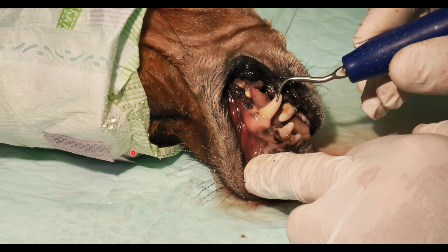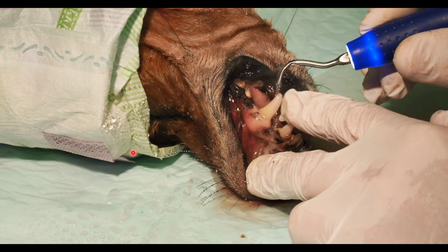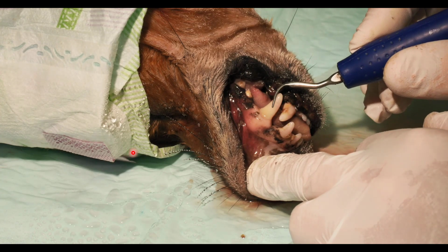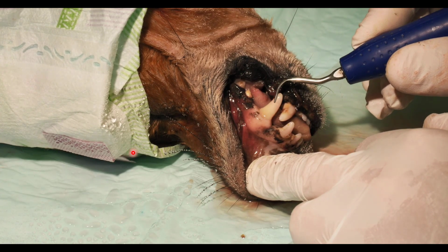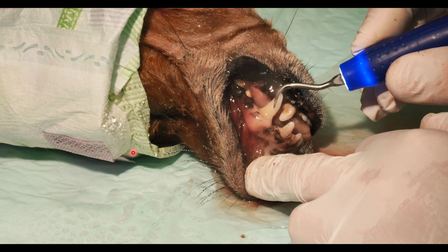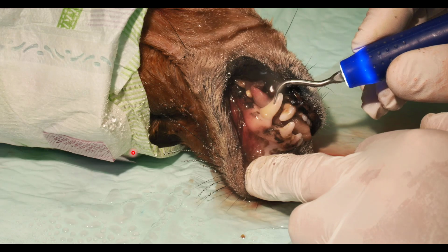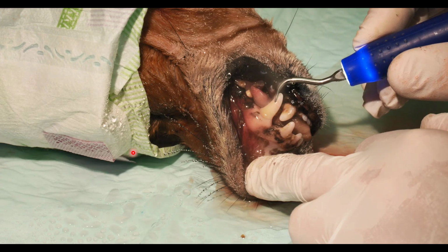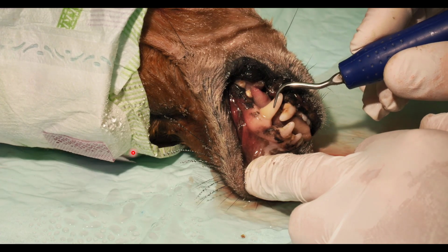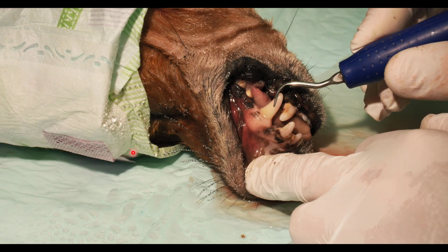There's no scientific evidence that says that a well-cooled ultrasonic instrument will ever overheat the tooth. As a matter of fact, the study showed that if you left a well-cooled ultrasonic instrument in contact with the tooth for 1 full minute, it did not overheat the tooth. Yet, if you put an uncooled ultrasonic instrument, like you turned the water off and ran it dry, it overheated the tooth in 1 second.